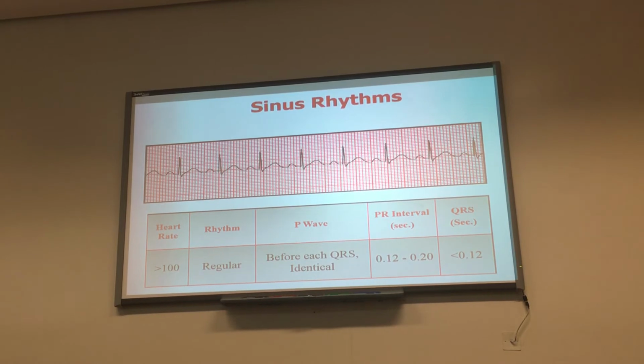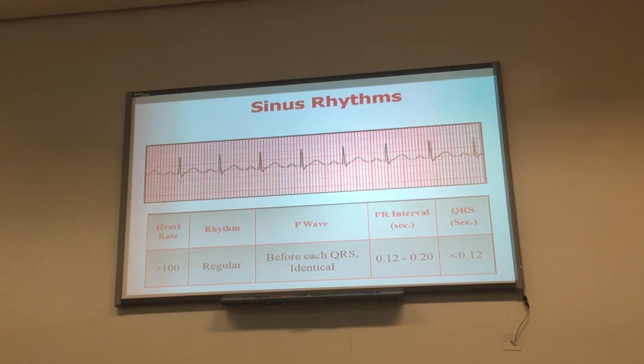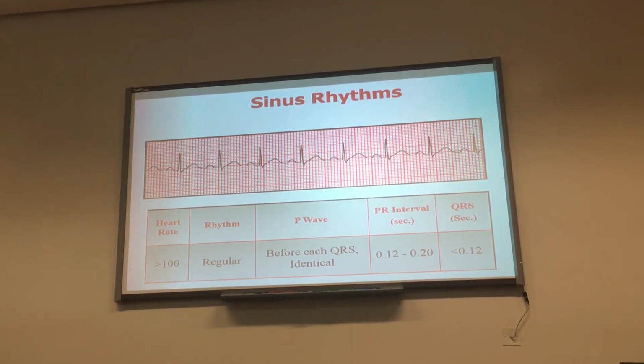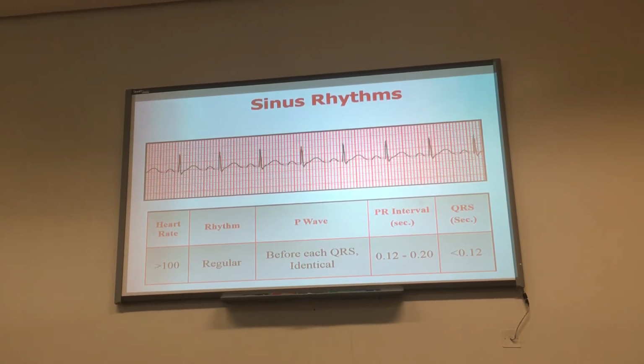You have a question there? Yes, sir. The number of squares should be 2 to the... Okay, calculate it. It does not make a difference, but definitely, because 300 divided by 3 is 100, anything less than 3 squares, we are dealing with tachycardia immediately.